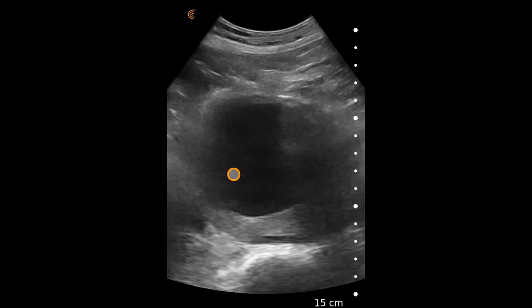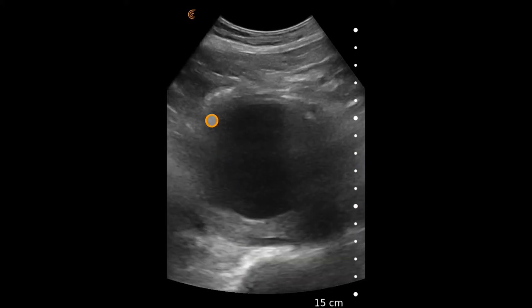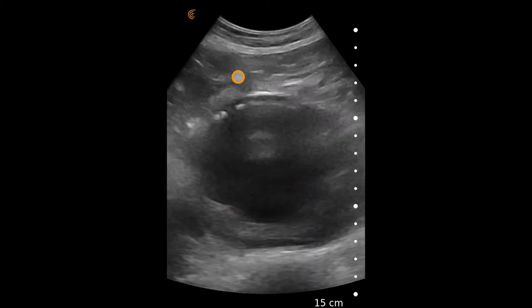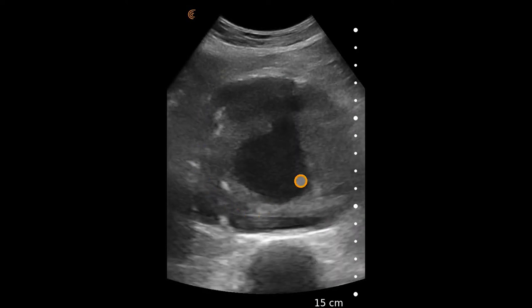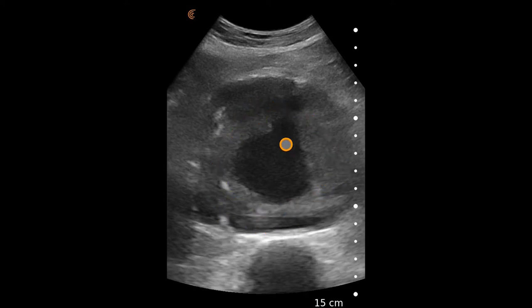As we scan a little further, we can better delineate the differing echogenicity here in the abdominal aorta, which is suggestive of mural thrombus. The true lumen is visible in the center of the aorta itself. This case represents a surgical emergency.